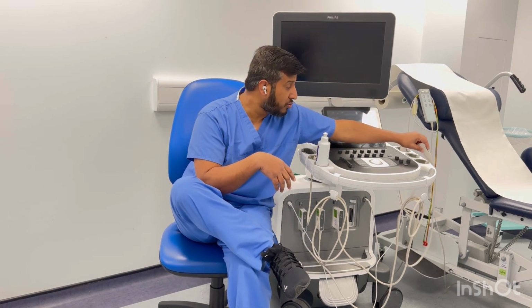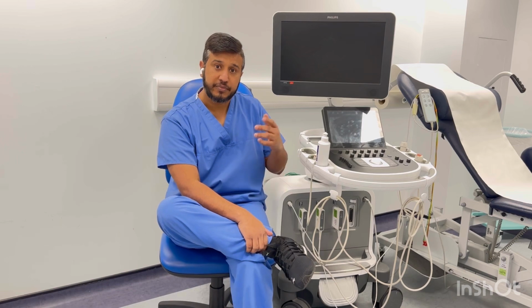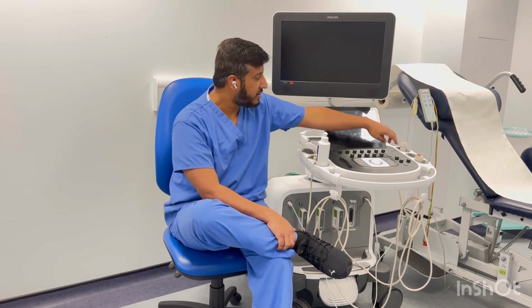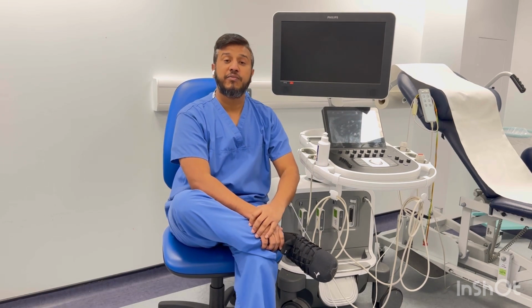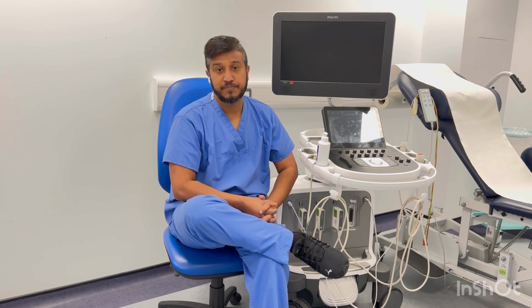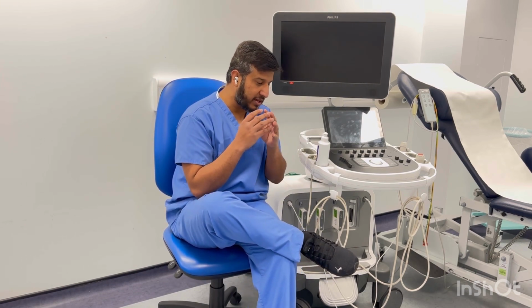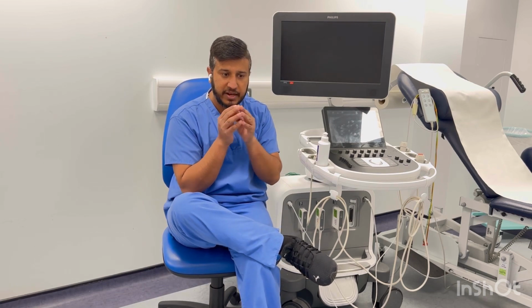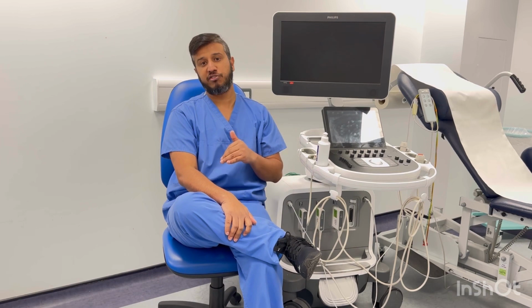So how will you know which probe you need to use for your patient? Whatever is written here gives us an impression about the frequency of the probe, and frequency has a lot to do with this. I need to give you a simple understanding: as the frequency goes up, your penetration goes down.